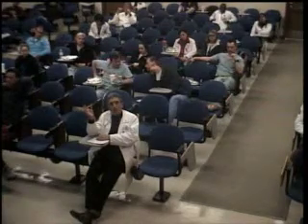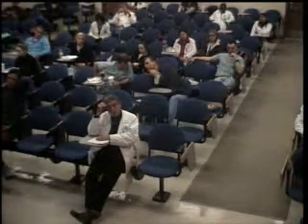And so this is mainstream, the way you are focusing the patients that are treated here. Yes, 90% of centers in the U.S. use CT triage for stroke. A lot of them, the ones that already have stroke centers in place, they probably add the CT perfusion to their stroke workup. So they do CT, CTA, and CT perfusion at the same time when the patient goes in. I think that should be our goal to get there, to do CT, CTA, CT perfusion. But I know it's hard, and that's why the aspect score comes into place, and we can maybe start with our CT, CTAs, and then improve on that to a point where we can get CTP.